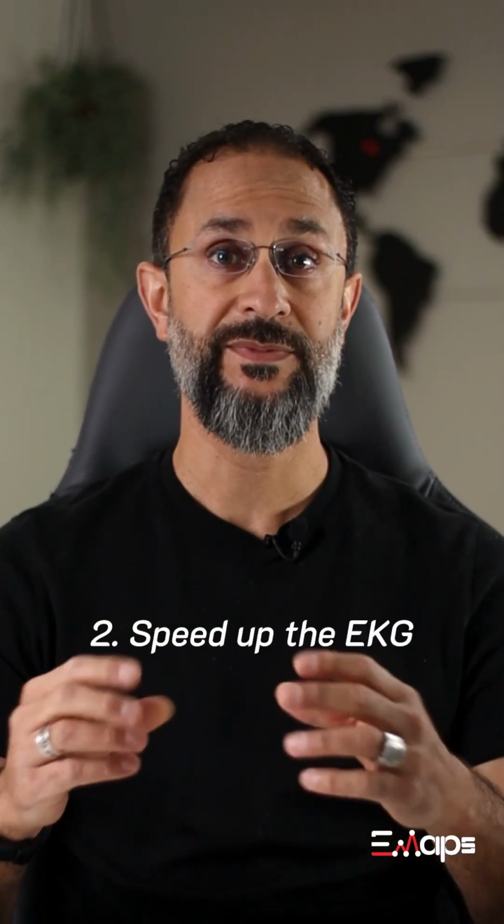Tip number 2, speed up the EKG machine. When we normally get EKGs, the speed at which the EKG paper runs through the machine is 25 millimeters per second. And that's our standard. But if you speed up the machine to 50 millimeters per second by changing the settings on the machine itself, what will happen is that the EKG tracing is going to move faster, and the tracing that's going to be printed on the paper is going to be stretched out. And this will allow you to look at what happens behind that P wave that you were able to see on the original EKG.